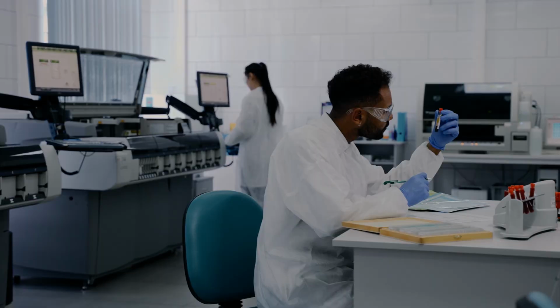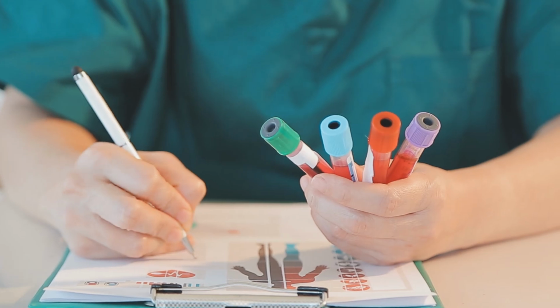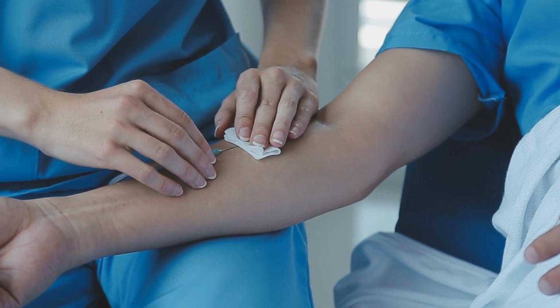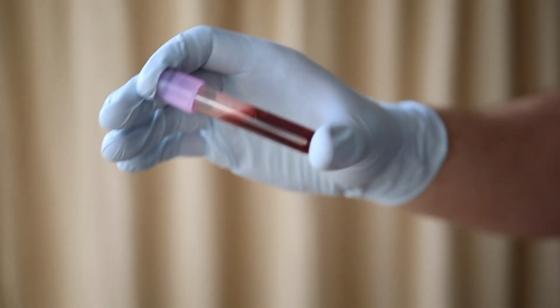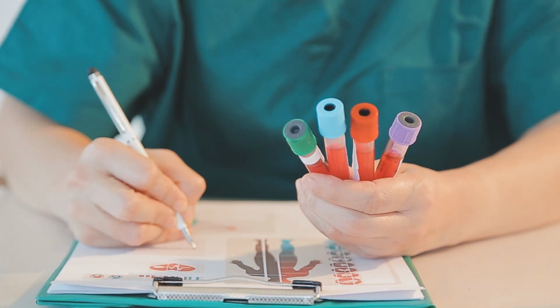Here are some of the tips for everyone who collects blood. Always check the tube color and label before drawing. Use a single-use needle for each patient to avoid cross-contamination. Never shake tubes, gently invert them. And always document your collection order if multiple samples are drawn.